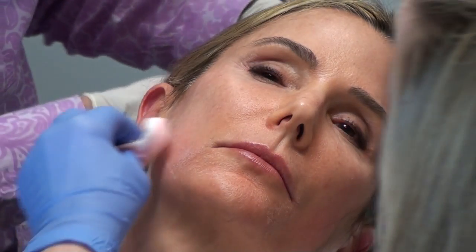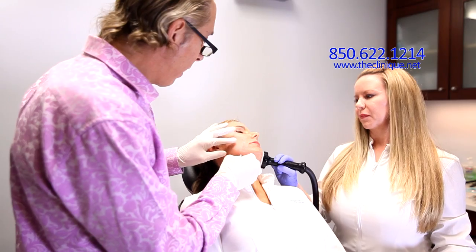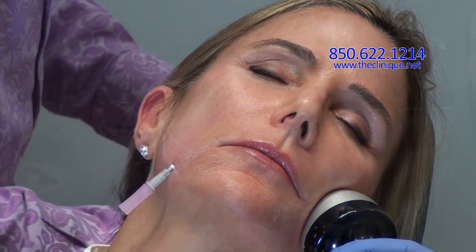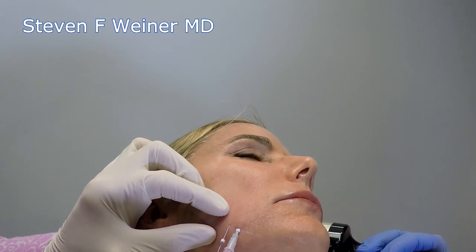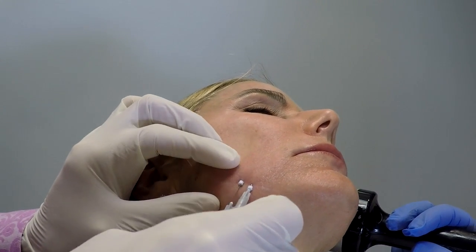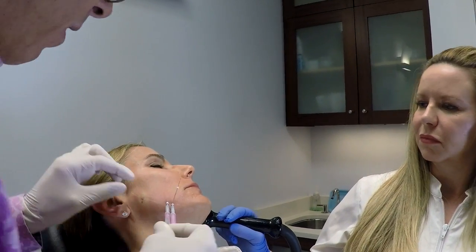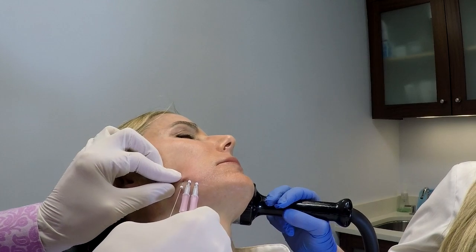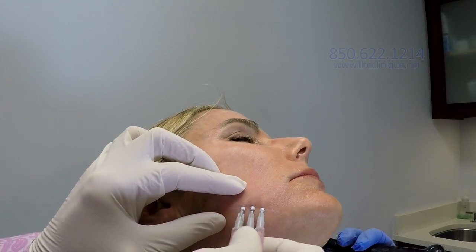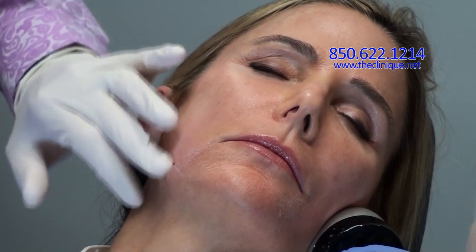Now I'm going to do the smooth threads. I'm going to do these in a crisscross fashion like I told you, right in here. Okay, this is for the crepey skin in the cheek area. And so this is smooth. So it doesn't have any barbs on it. And what this does is it produces a collagen reaction. And this is typically what you do. You kind of put in so you know where you've been. You put them in together, and then you just remove them. And you see there's minimal bleeding associated with that.